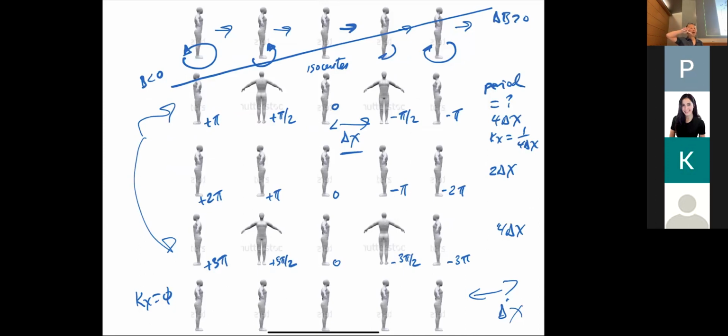Okay. So at that point in time, even though this guy was spinning around, he's gone back to zero. So what you care about is at every point in time, what is the phase, the relative phases of all the spins? Because at any given point in time, you don't necessarily know the history, right? You're just looking at this point in time and at where these spins end up. So at the last row, after these 1, 2, 3, we've taken 4 steps of time, and with those 4 steps of time, we've ended up back at zero phase for all the spins.